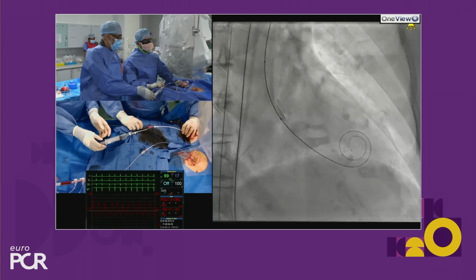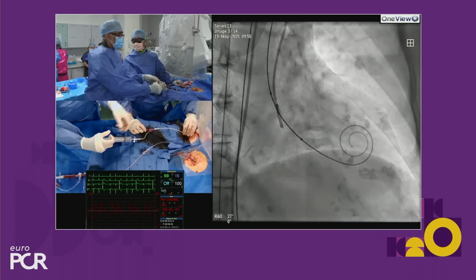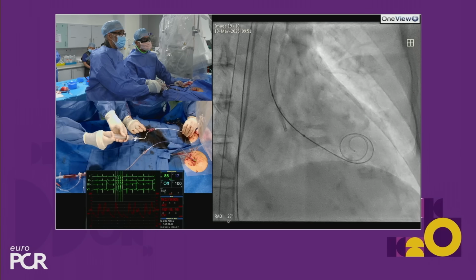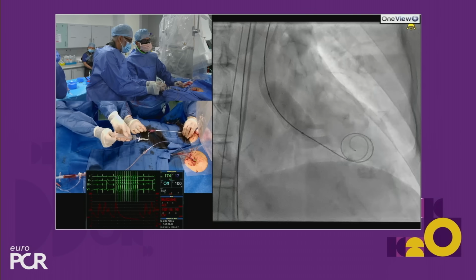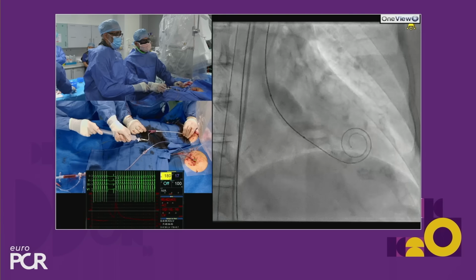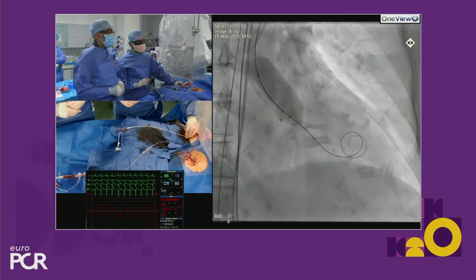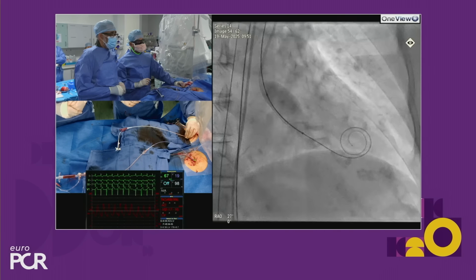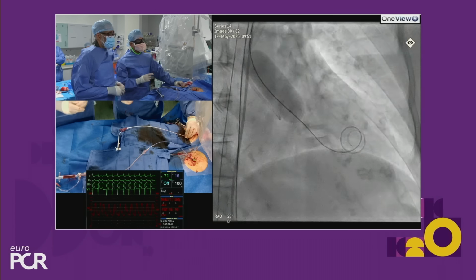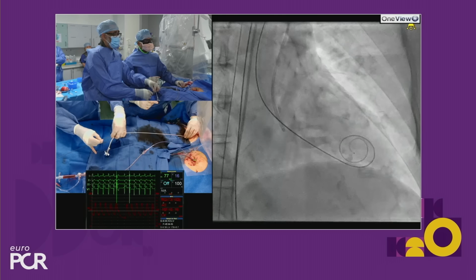Okay, it's coming. Feeling a bit stiff, is it? Okay, so that's actually very good. Yeah, so pacing on. Okay, 180 there. Yep, balloon up. Yep. And down. We got it there. Pacing off. We got it as it expands as well. Now we can see the ECG has changed slightly to a bundle branch block pattern. So let's do the inflation. So it's caught. Okay, so I think we've caught it. Fine. So I don't think we need to re-inflate. So we'll take this back out.